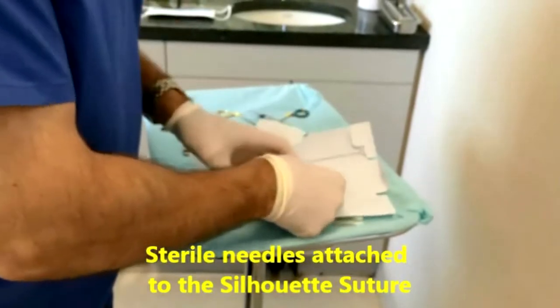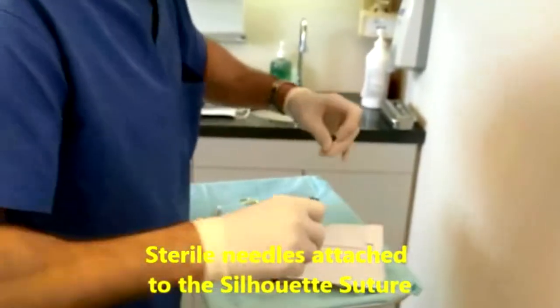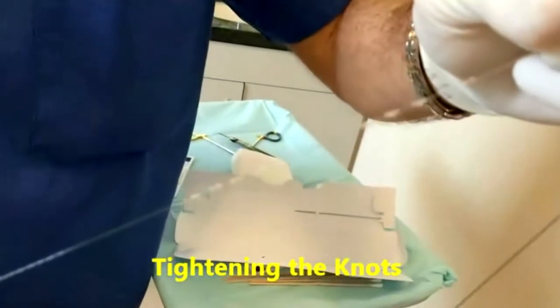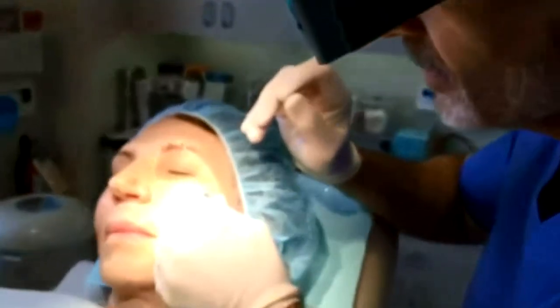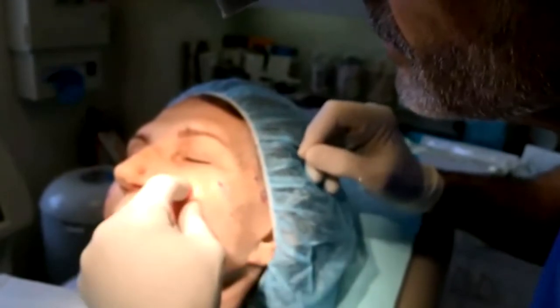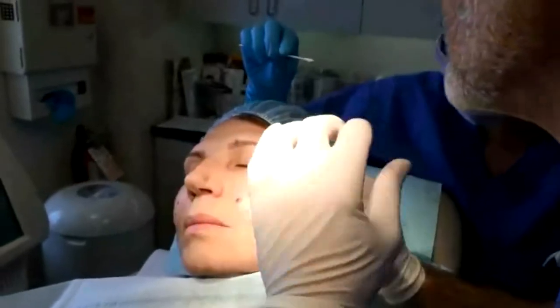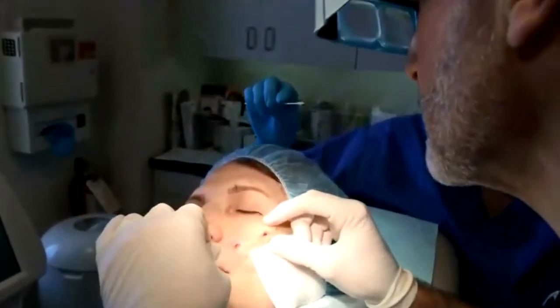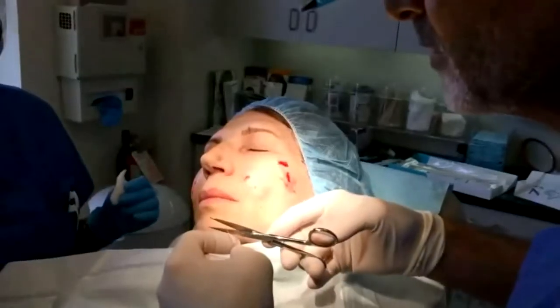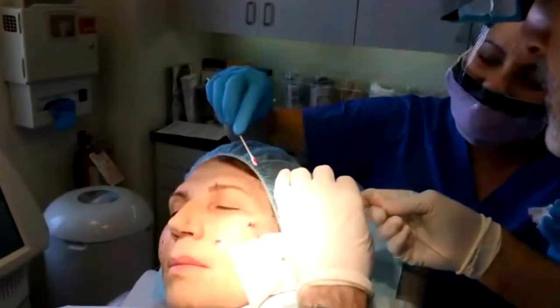InstaLift suture lifting takes about 45 minutes in the office to do. A simple local anesthetic — so you're not under general anesthetic — is used in the face to insert little areas of numbness through which a dissolving stitch is placed. The stitch, which is new and improved, has little dissolving cones that hold it in place, and after the suture is placed in the skin, the skin is then pulled back and held into position.